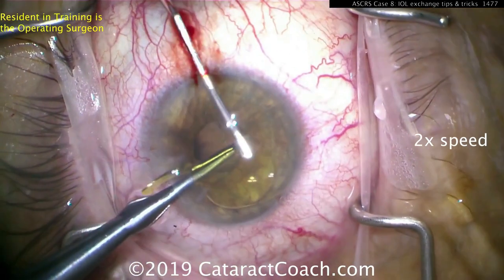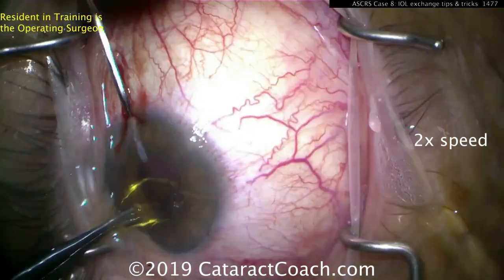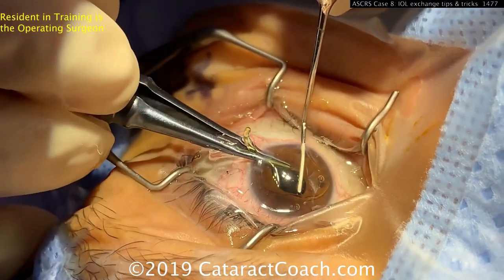Using the spatula here — the spatula goes above the optic to prevent it from touching the endothelium. Then you twist it and can pull it right outside the eye. That's the twist-and-out technique.